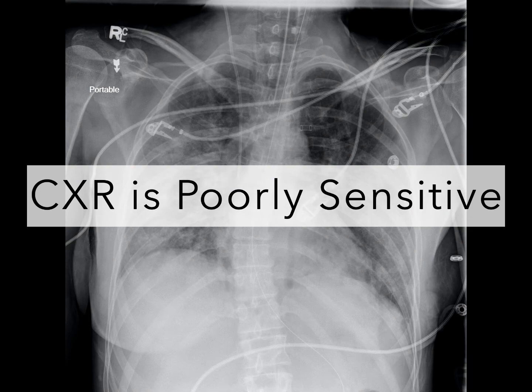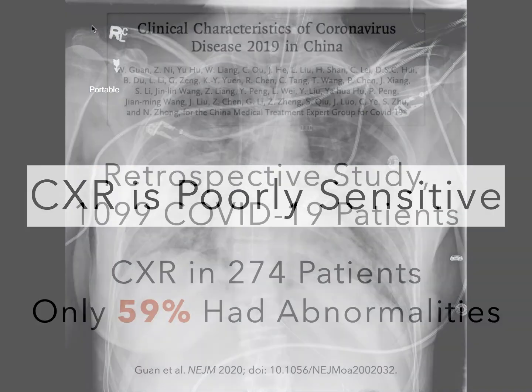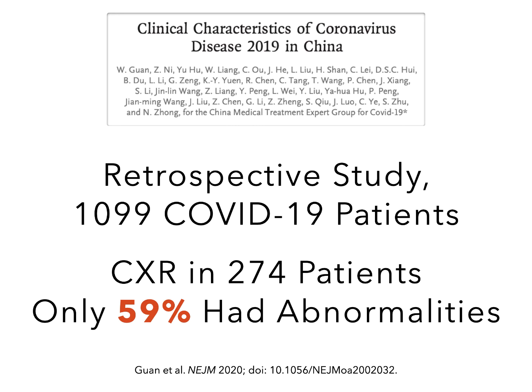Chest X-ray is poorly sensitive. Guan's study in the New England Journal of Medicine looked at almost 1,100 patients with COVID. 274 of these patients had initial chest X-ray, and only 59% of these demonstrated abnormalities.